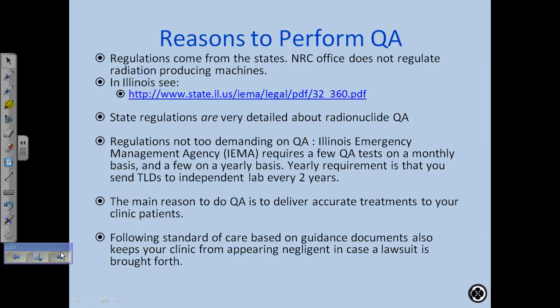And depending on what clinic you go to, the QA program will be either very generalized, or it'll be specific to each machine, and they won't be tied into each other. Okay, so the QA program should start as a general theme and a general way of thinking about QA, and then drill down to the particular machines. Or it could be machine by machine, and the philosophy of the QA could be different, which is not a good arrangement. It's better to come up with a philosophy for your entire QA program. And what I mean by philosophy is who's involved in it, how often you need to review it, and whether you need to have meetings to talk about continuing QA.